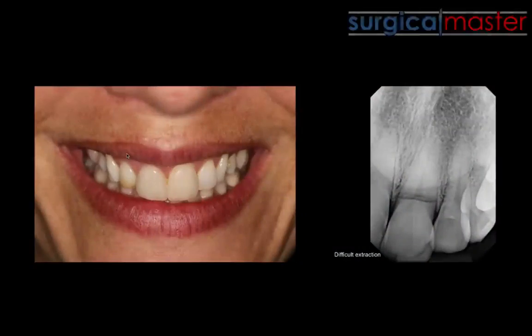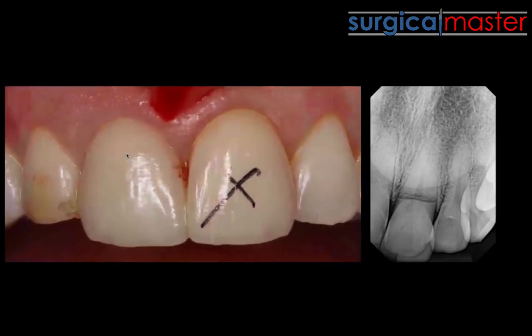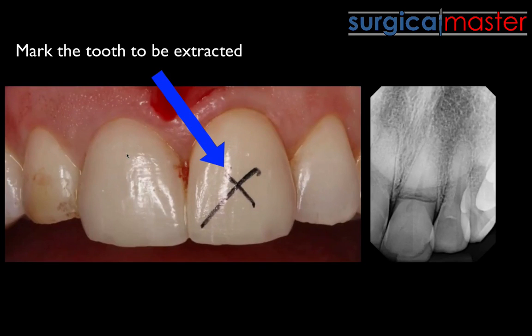The horizontal fracture is right below the osseous crest. We know there's no way we can extract this tooth and take it out as a whole — it'll come out in two pieces.